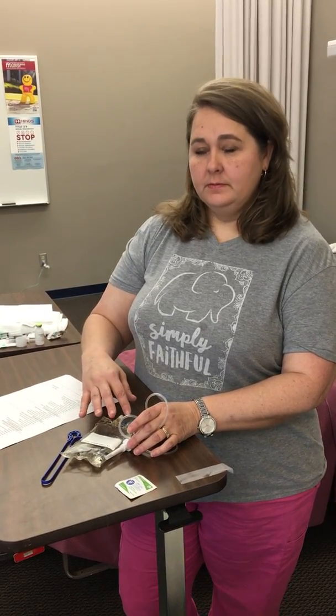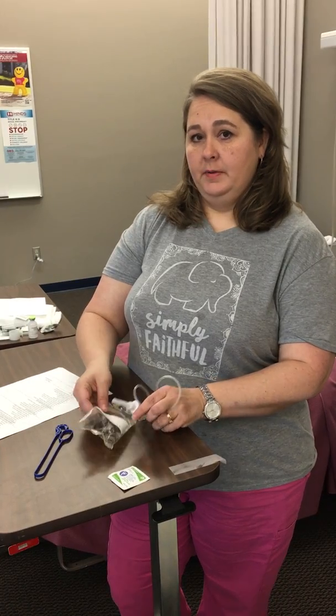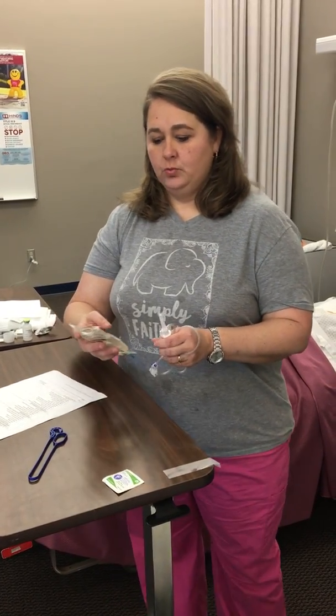Hi, I'm back once again to demonstrate another IV skill. Don't forget that you've already verified your MAR with your doctor's orders. At this point we're going to administer an IV piggyback through a primary compatible solution. We've already determined that our piggyback is compatible with the primary solution that our patient will have running.